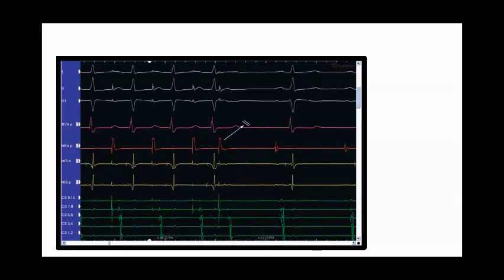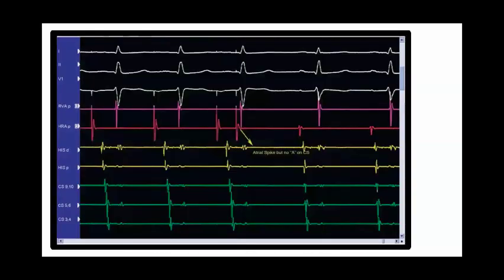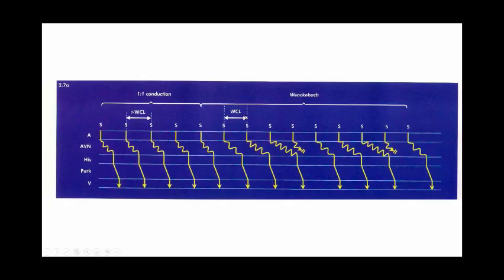So usually we don't take the patient inside the EP lab except after we have a documented supraventricular tachycardia. This is an example of reaching the refractory period of the atrium, and this is similar to what we saw from the ventricle, but here it is coming from the atrium to the ventricle.